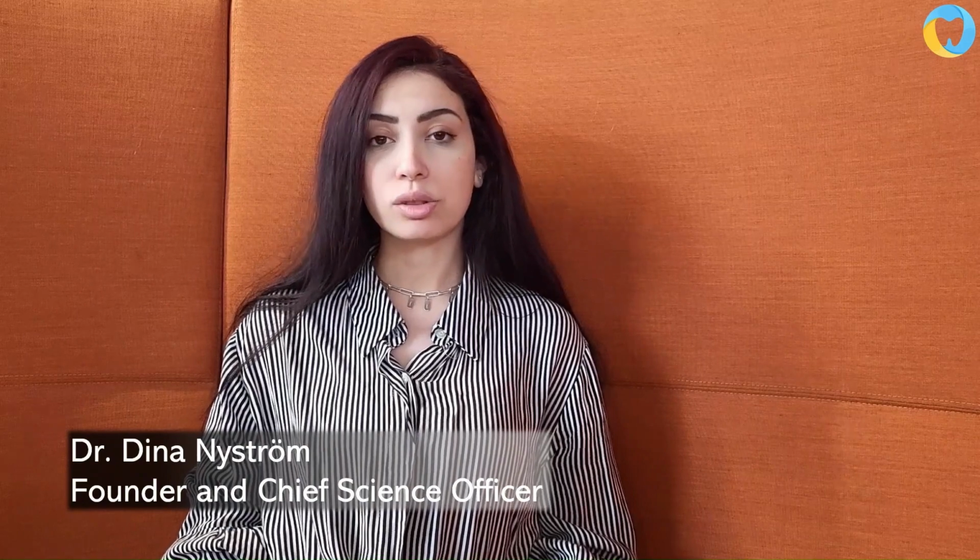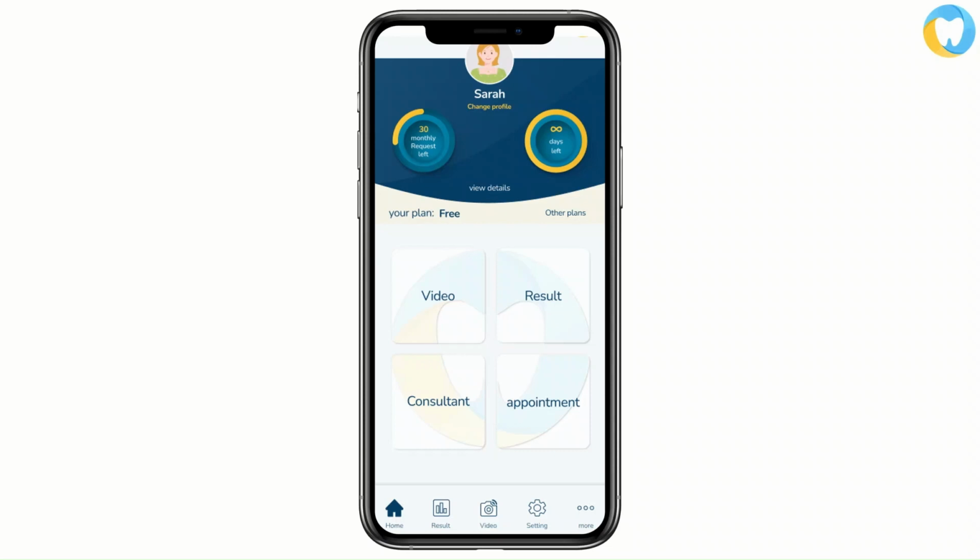perfect for families. It's an easy to use device, and it's also the first ever dental device that you can use from home. You can make diagnosis for all of your teeth just within few clicks. So when you first sign into our application, in the main page you will have many features.